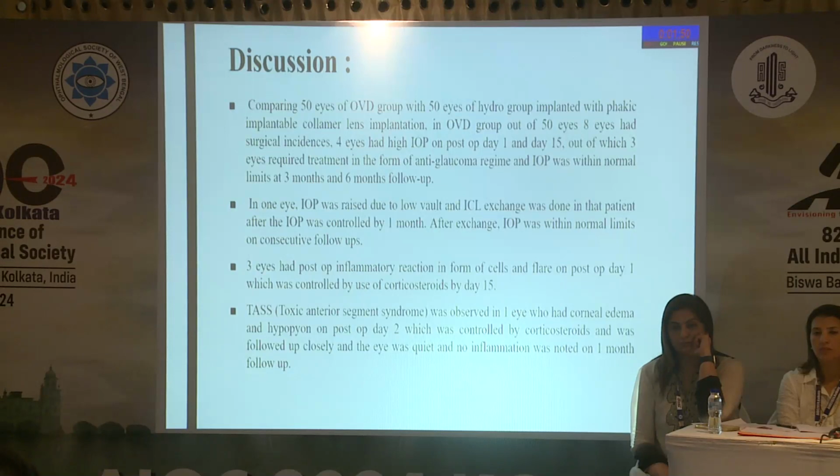OVD group had incidences in 8 eyes. In 1 eye, IOP was raised due to low vault, and ICL exchange was done in that patient, after which IOP was controlled by 1 month. 4 eyes had high IOP on day 1 and day 15, and 3 eyes were maintained with anti-glaucoma regime.